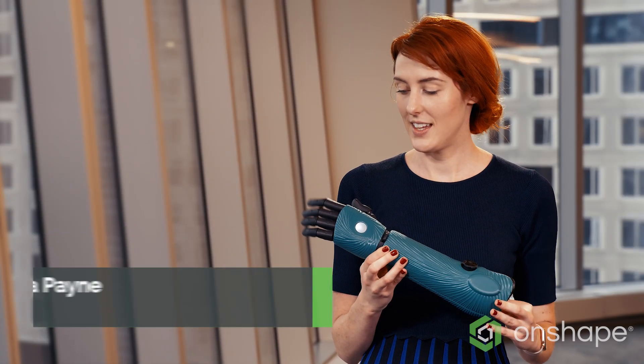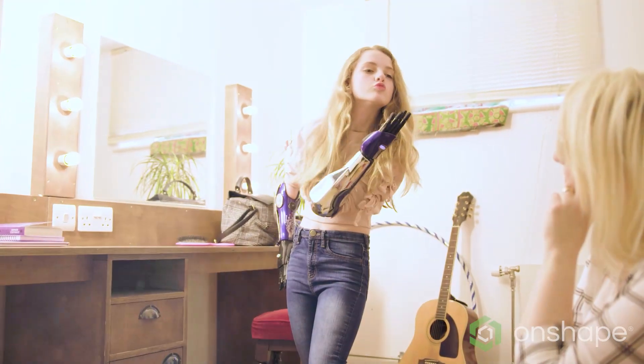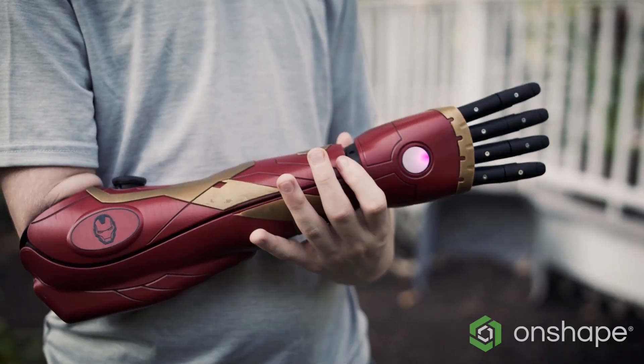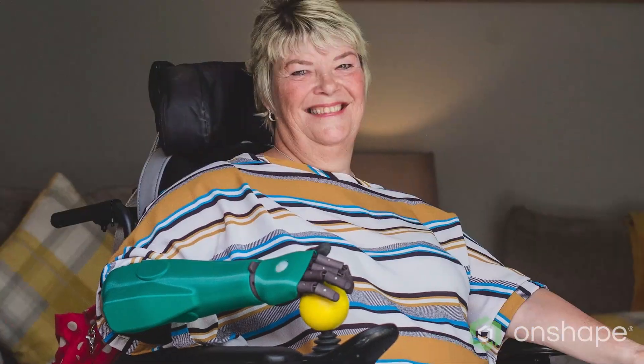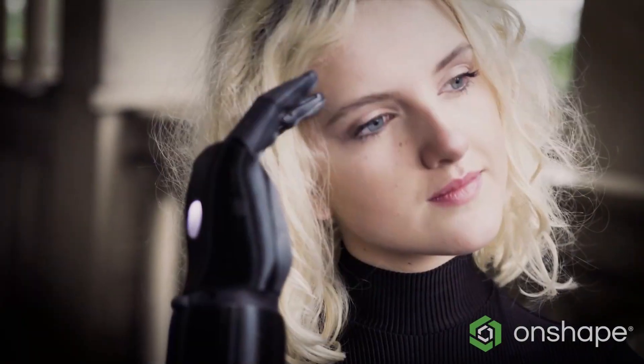This is the Hero Arm — a 3D printed bionic arm for amputees. It has multiple grips and lots of different functions. This can be an extremely life-changing device; it enables people with one hand or no hands to be able to do much more. The Hero Arm is unique in that it's a full bionic arm and you can completely customize the style of the limb. One day you could be Iron Man, the next day you can decide your favorite color is green and have a green skin.